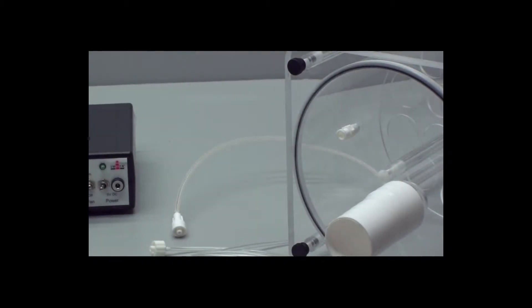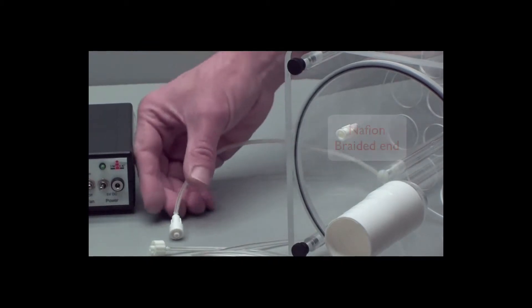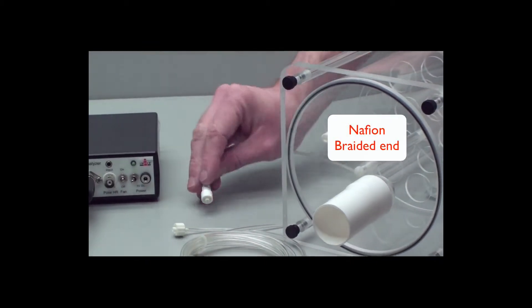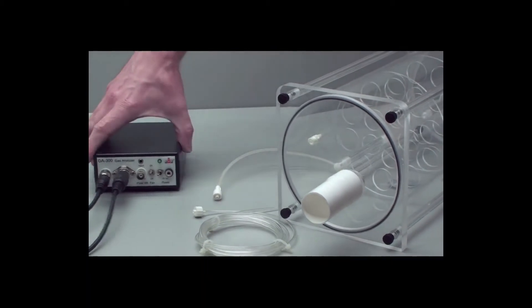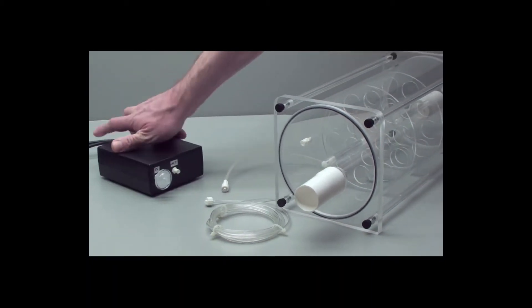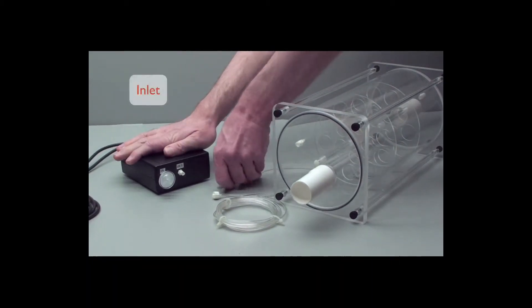With the Nafion clear tubing, find the braided end, and that goes into the inlet of the gas analyzer on the back side.